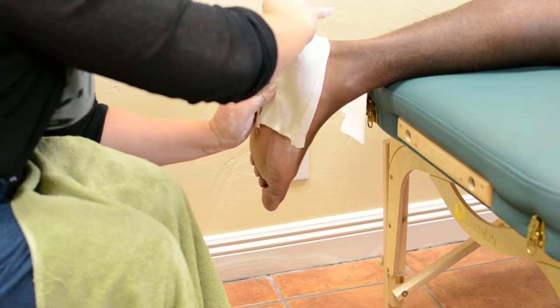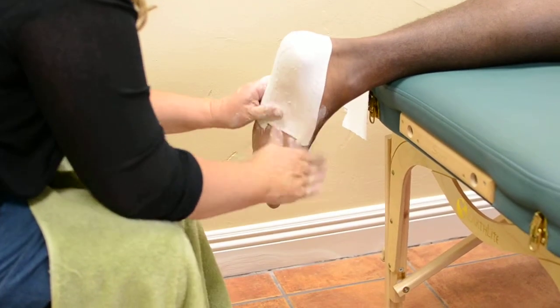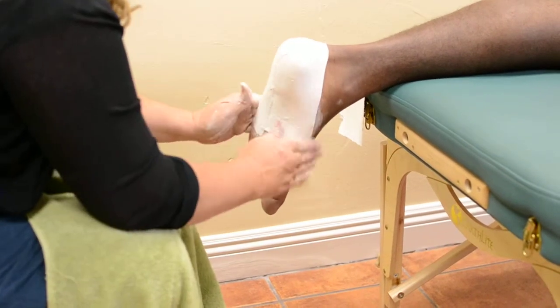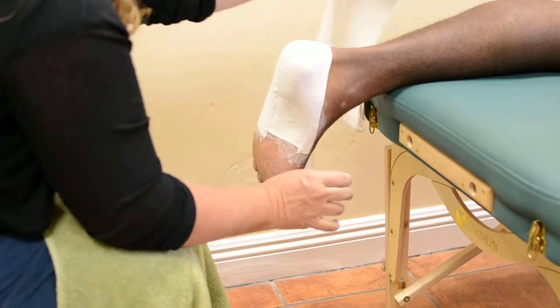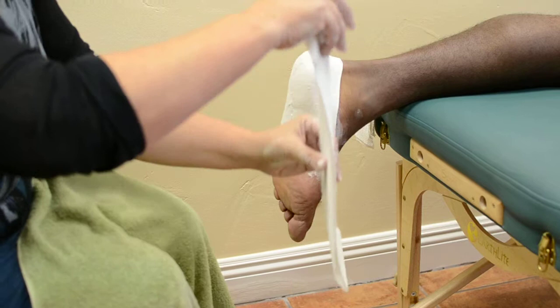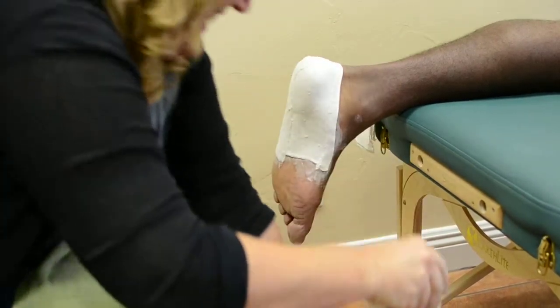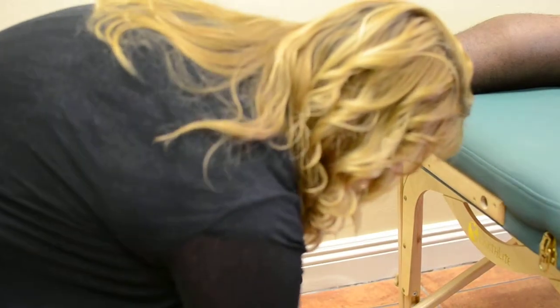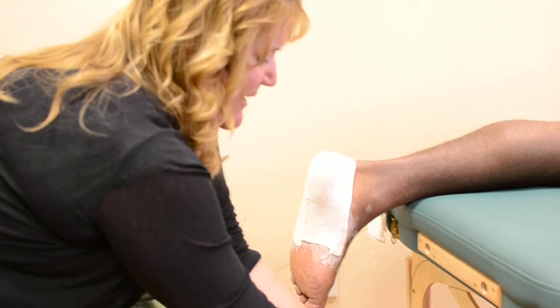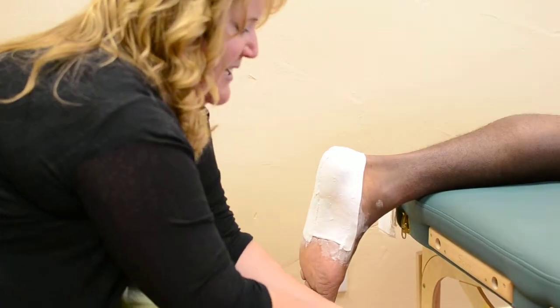And we'll have the cast on file, so when he gets his professional playing cleats, then we could just send the cleats in, and you could custom make it for those cleats, right? So here's something you guys are going to have to do, because we do this for all the professional players and all of USC athletes. We store the casts in what's called a pro player box, which means that we do keep them indefinitely, because athletes have a tendency to bounce from team to team.